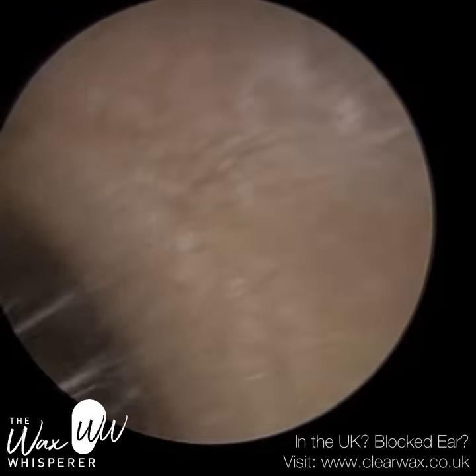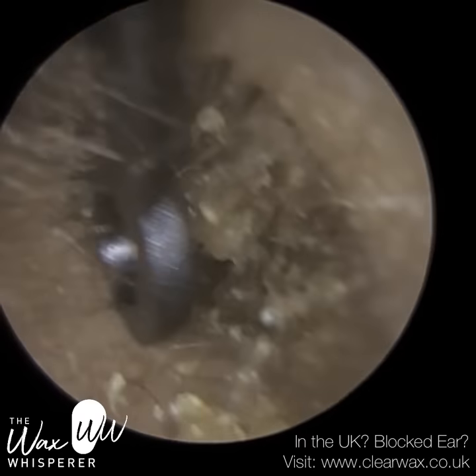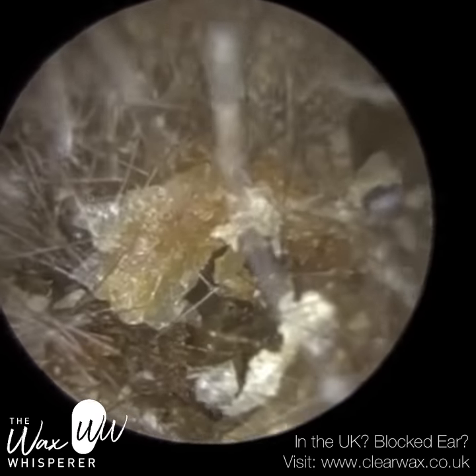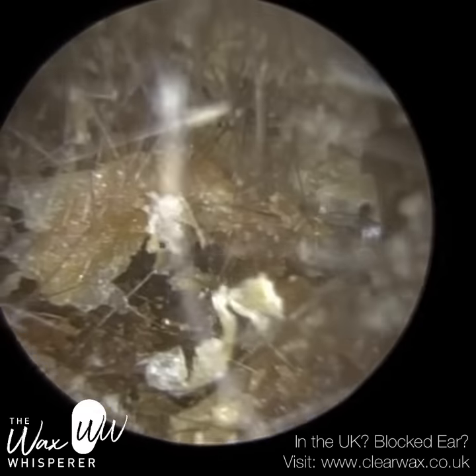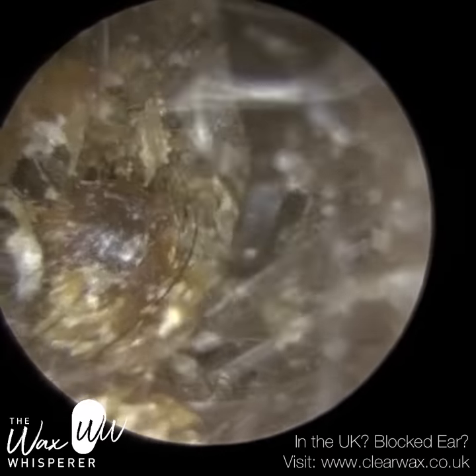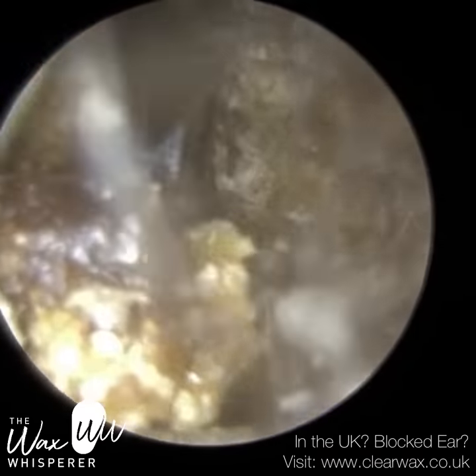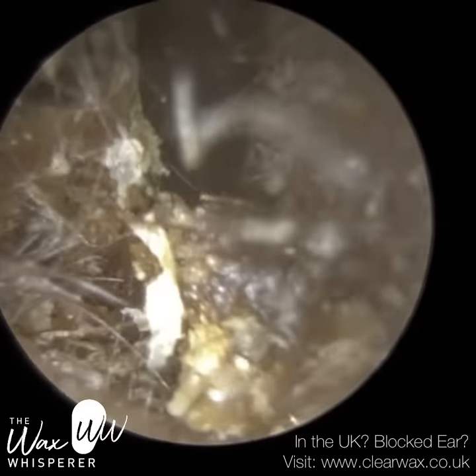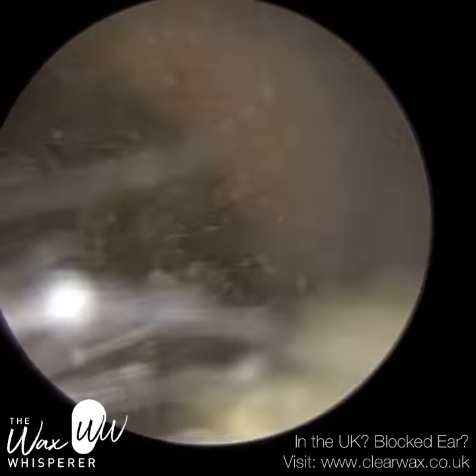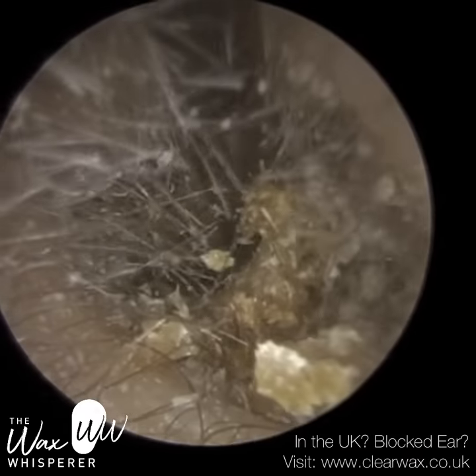I did ask the patient whether they trim their ear hairs. They said they don't. So it's a bit of a conundrum as to how these hairs got there, because the hairs in the ear should only grow in the outer third — the cartilage portion — that's where the hair follicles are. In the osseous part of the ear canal there are no hair follicles, so it's not possible for hair to actually grow in the inner two thirds of the ear canal.